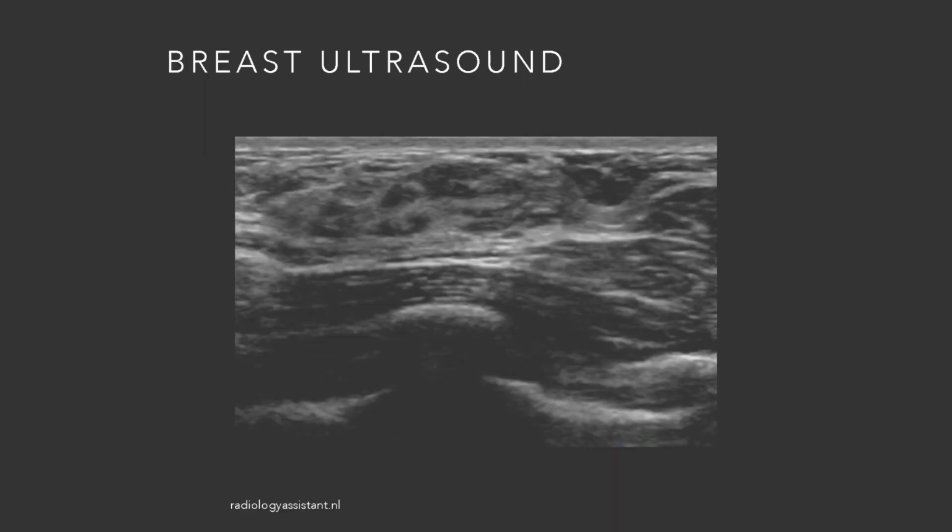So here's an actual breast ultrasound image, and if you can remember the graphic that we just showed, we see skin at the top, and then the fibroglandular tissue, muscle, and then rib is the white spot with black behind it. The rib is very dense, so it blocks all the sound waves from traveling past it, and so that's why we don't see anything behind it.